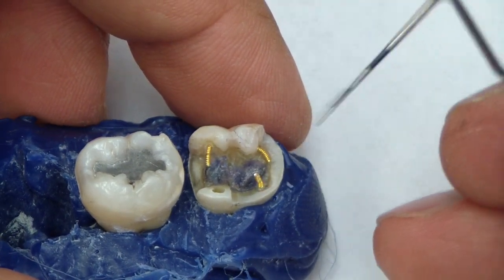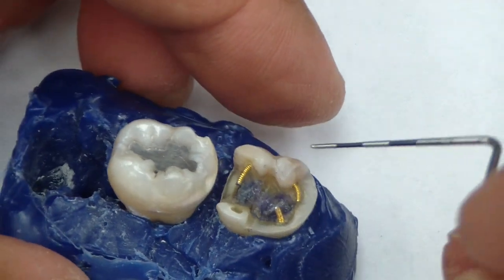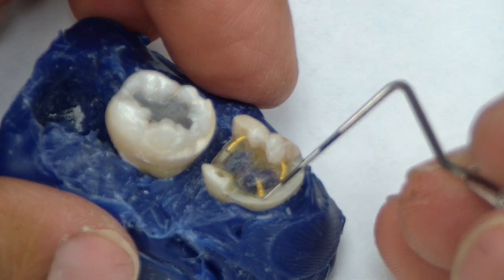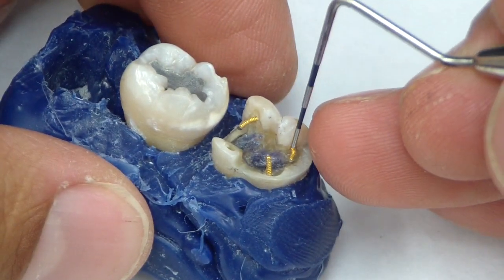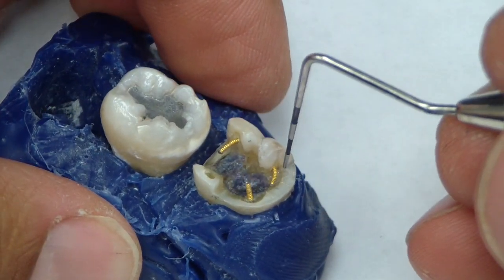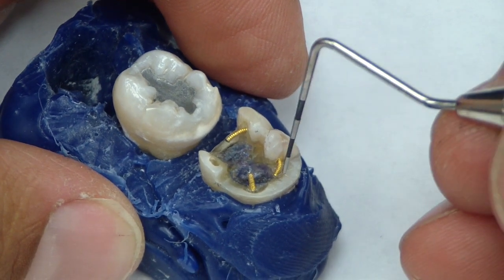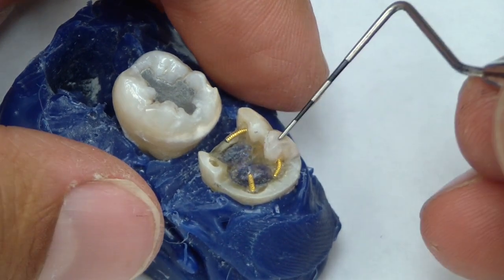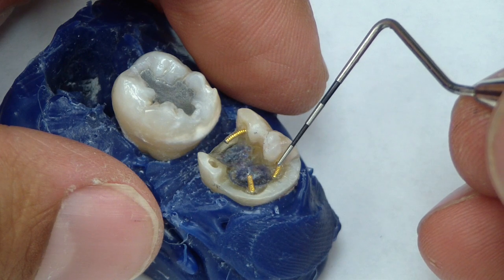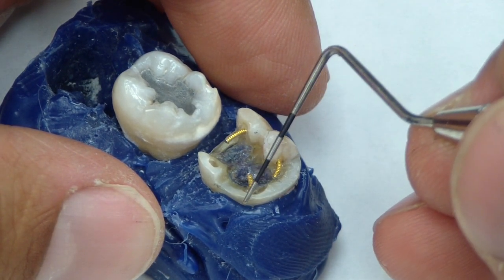We have vertical pins — they're 0.5 millimeters in from the dentin-enamel junction. We have some microscope footage of placement and you can see the exact location. And also these horizontal pins. Burgess published an article discussing horizontal pin placement and prevention of not only fracturing of the cusp, but also the amalgam rotating lingually and fracturing off this portion with the pin.